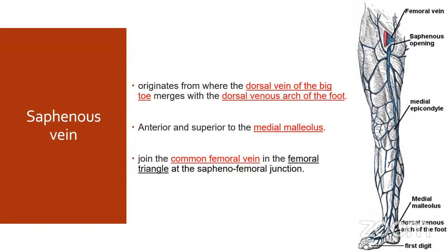Exactly. So if you see larger branches, do not cut it out, just like Abdullah said. But actually what you need to do is dissect more in both areas and find out which one is bigger that you can use. Occasionally, the bifurcation of the venous system will be helpful in a way that you can use it as a bifurcated graft. So do not miss that opportunity, okay? So you'll have only one proximal anastomosis and two distal anastomosis. That can happen only if your dissection is from distal to proximal, so starting at the foot and going up, and you find the bifurcation. Those are very good opportunities and branches.